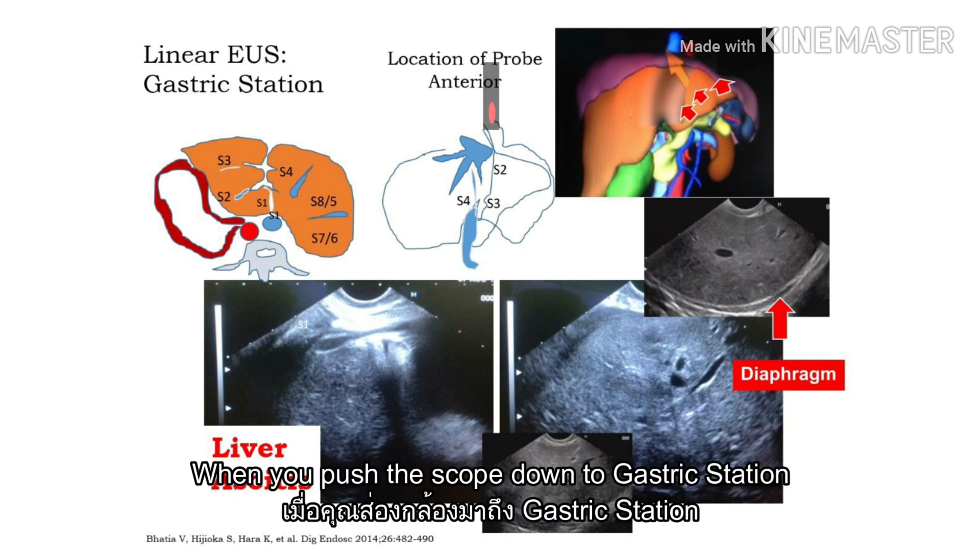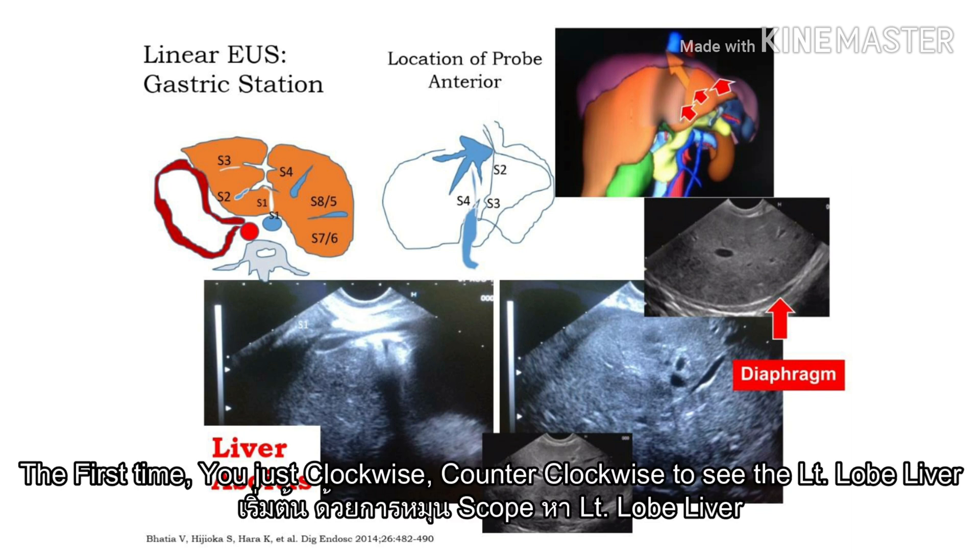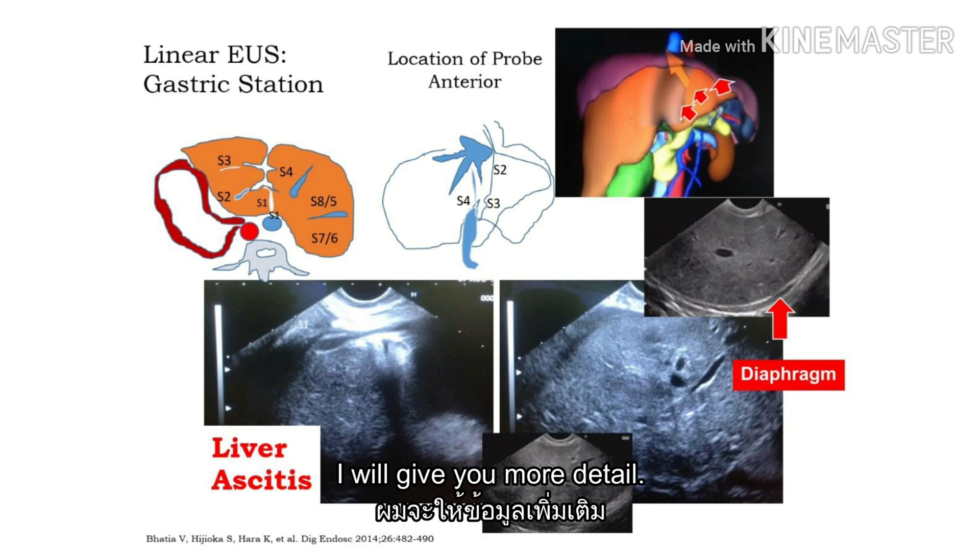When you put the scope down to the cardiac station, you can see the left lobe of the liver. The first time, you just go to see the left lobe of the liver. I will give you more details.